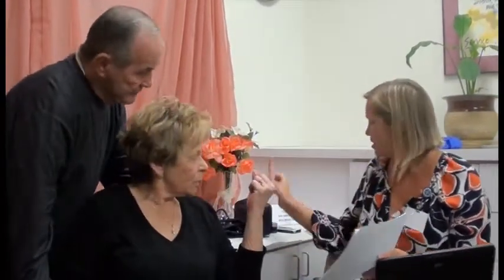So we'll need your daily dry weight. What that means is, first thing when you wake up and you use the restroom, jump on your scale. We'll provide one for you with this home health monitoring system. And then we'll want you to do your O2 sat, and then we'll write that down as your baseline. What is the O2? That's this monitor right here. Oh, okay. Correct.